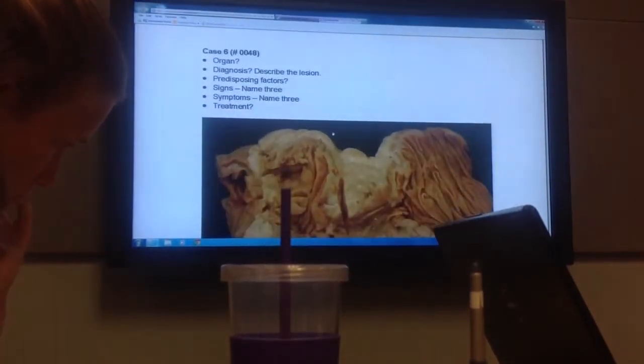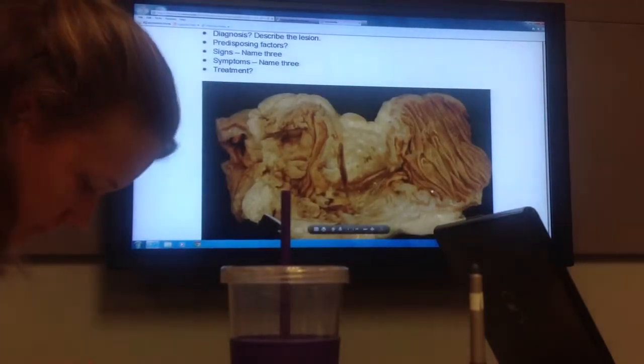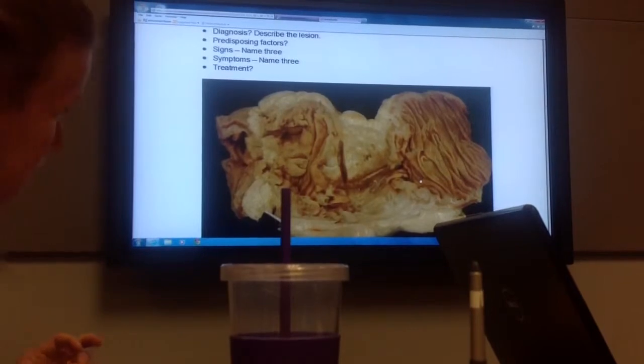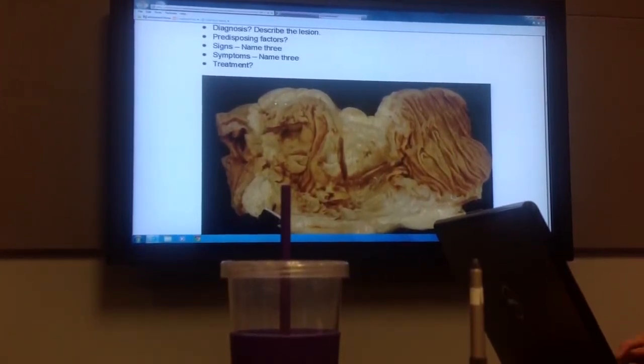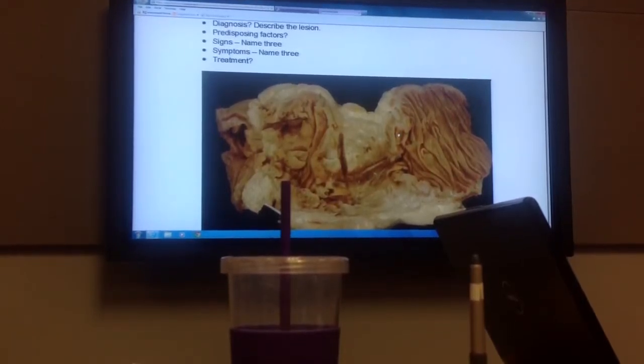Okay, and here is a disgusting one. Obviously we have kind of an enlarged intestine. This is the usual configuration. Here's this thing, and then here's something down here. So it looks like some big nasty tumor that's kind of all over the place, right?